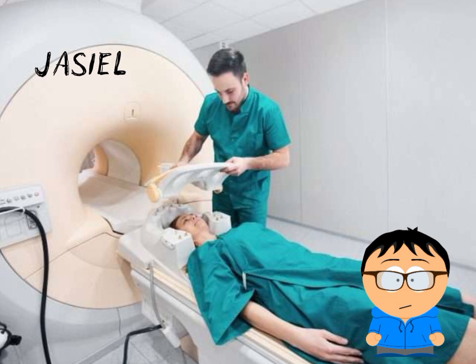4. Computer, which processes the received signals and transforms the data into images that radiologists can interpret. 5. Examination table, where the patient is positioned during the scan. The table can move in and out of the magnet. 6.